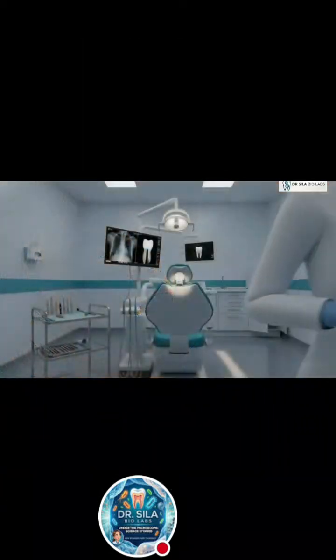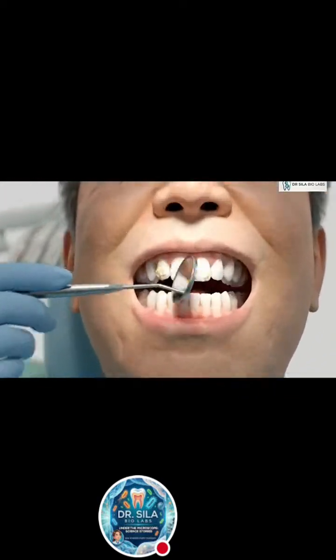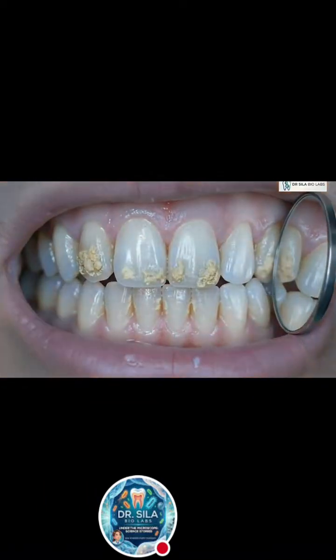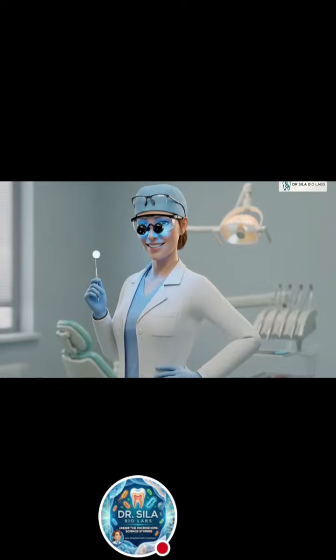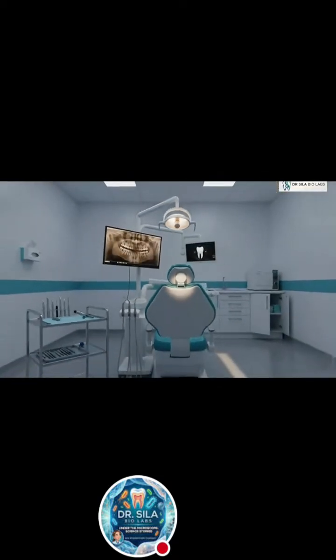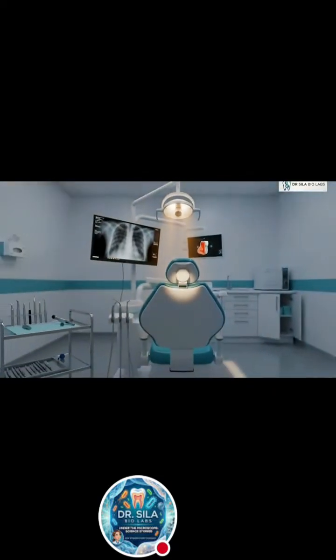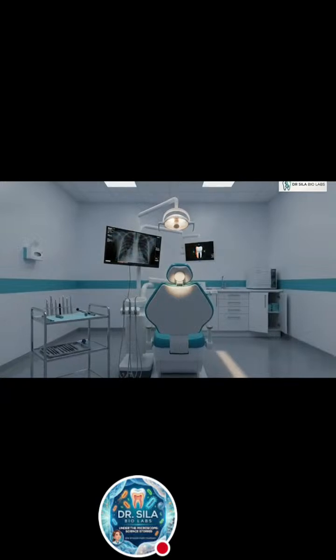Signs of gum disease are checked in the chair, paying particular attention to the depth of the gum pockets. In healthy gums, these spaces are shallow. Deeper pockets may indicate periodontal disease. Radiographs reveal bone loss that may not be visible during routine examination. By combining clinical examination and radiographic findings, an accurate diagnosis can be made.